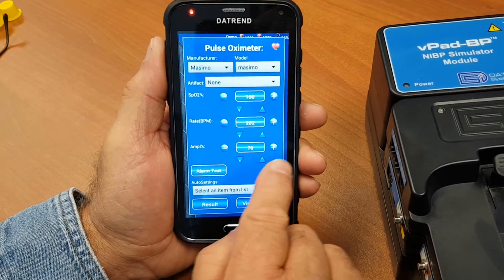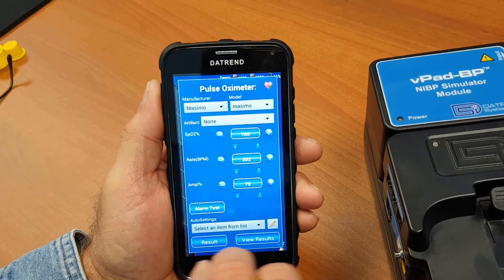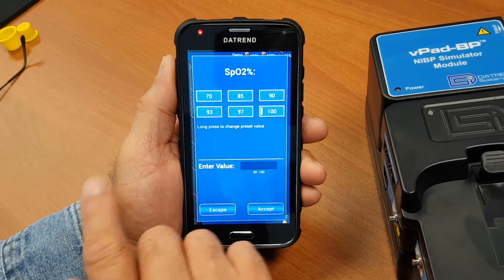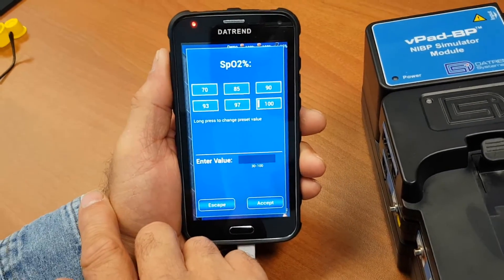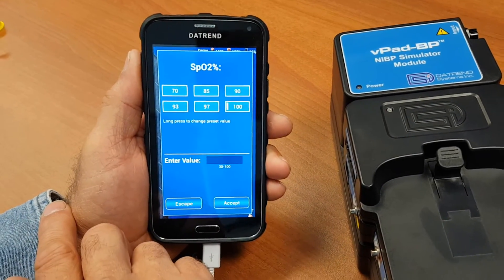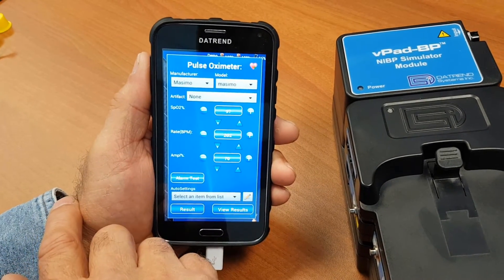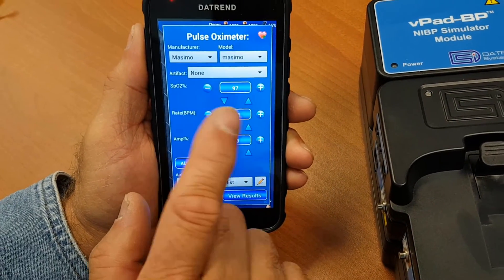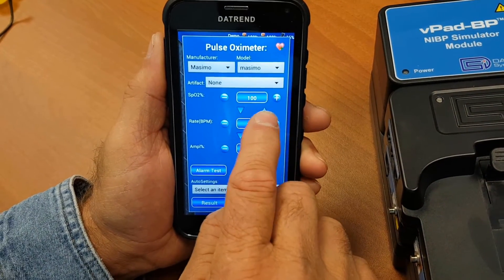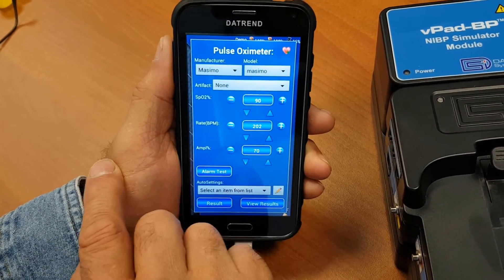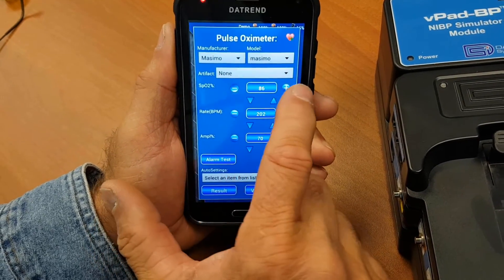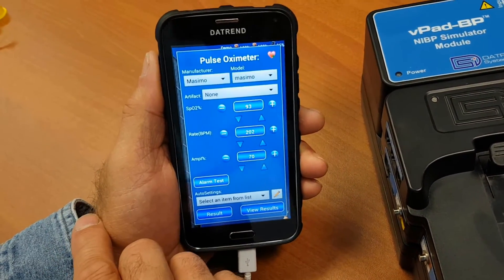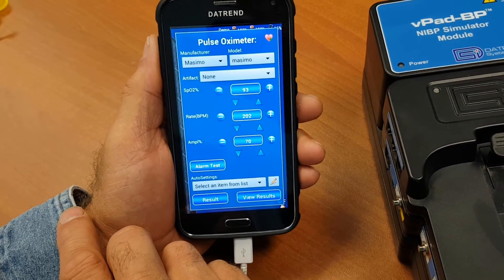The controls are quite comprehensive. If you want to go through a table, you can use your own preset table and create whatever values you want in it. The currently selected entry is indicated by an orange bar. You can select a value directly from the table, use the up and down arrows to go through the presets, or use the plus and minus keys to step through values one at a time. These are common controls throughout the system, making it easy to move around and make selections.